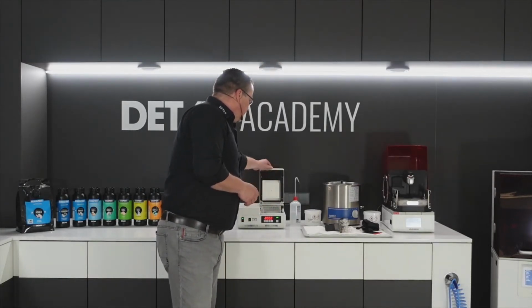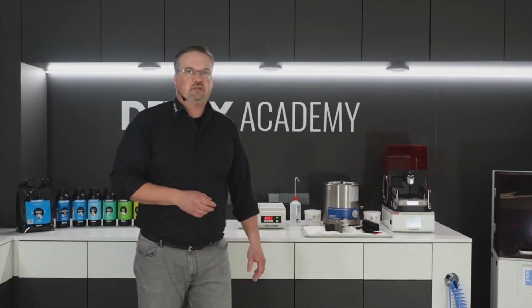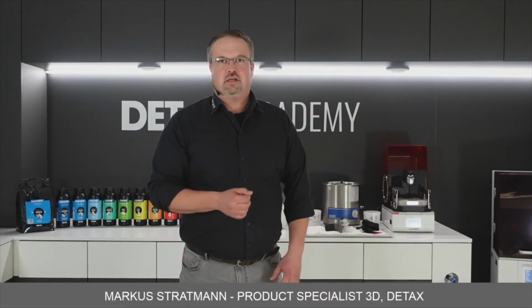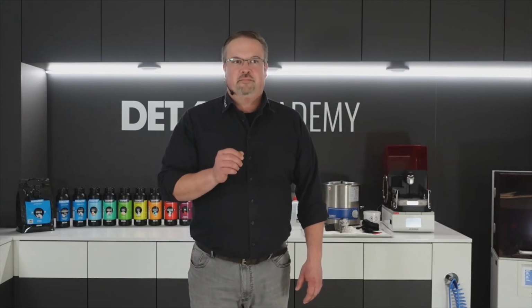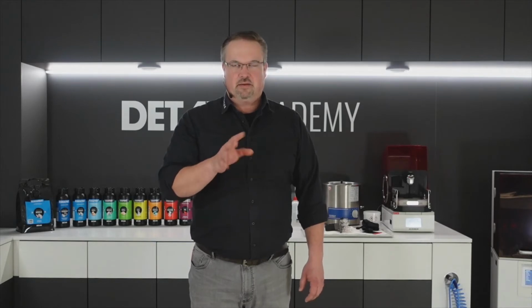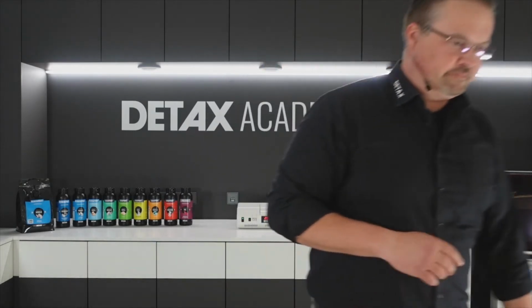Okay, so now we can final cure it 2 times 2000 flashes with the Otoflash machine. And after that, we are ready to fill the casts with our Softwear 2.0 silicone. I will show you this and also the peeling of the casts and some more tips and tricks on the working place. Come on.